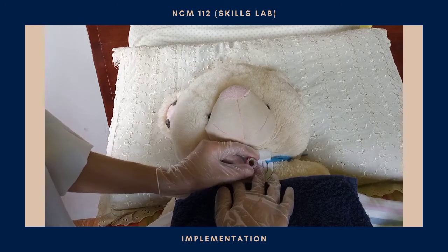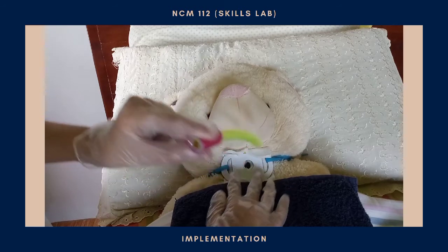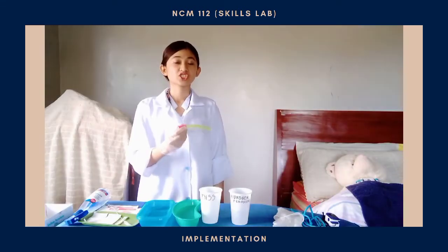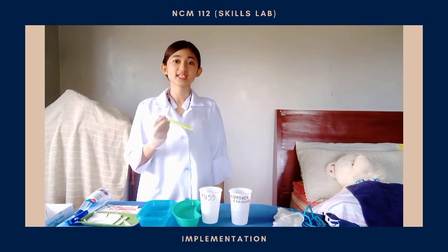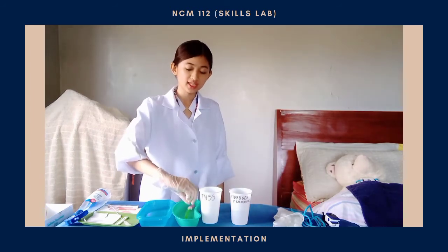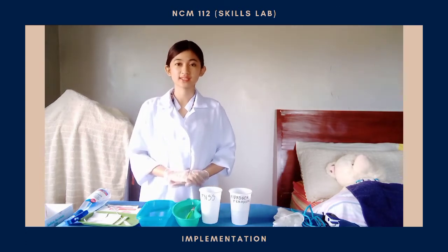Okay, ma'am, can you take a deep breath for me? Then remove. Check the inner cannula and the outer cannula for any secretions or drainage and place it in the first basin with the plain normal saline solution and the hydrogen peroxide and let it submerge there for a few minutes.